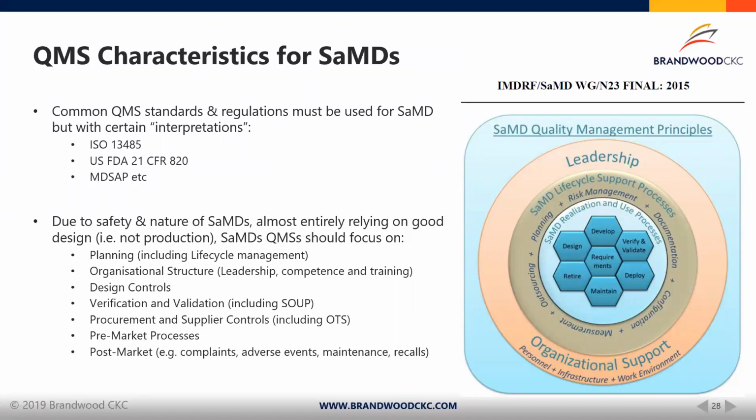However, certain subsystems within a quality management system need to be interpreted according to the software lifecycle processes, as software itself has a unique development process. And the key differentiator within the quality management system for software is that there is no physical product being produced, and therefore the QMS production processes do not generally apply for software.